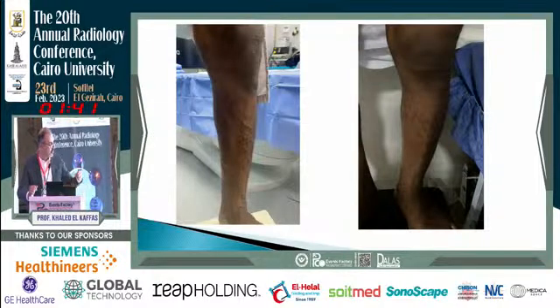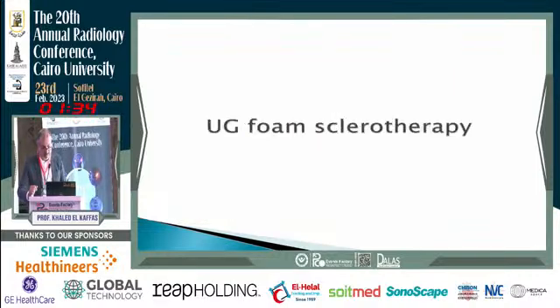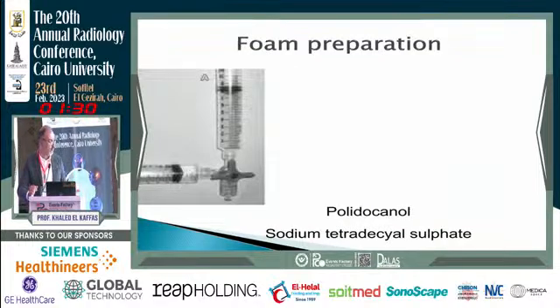Here's the patient after ablation. Total disappearance of the varicosities in the lower extremity. What about non-thermal ablation? We'll talk about ultrasound guided foam sclerotherapy. It's a very easy maneuver.